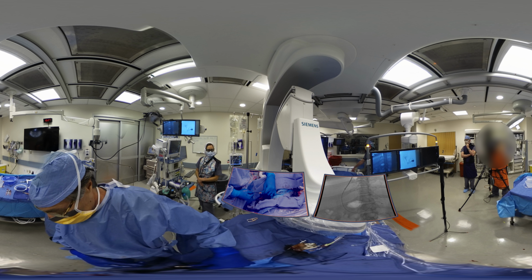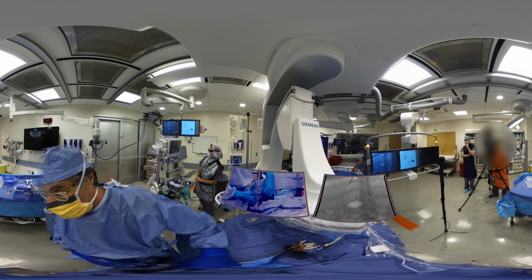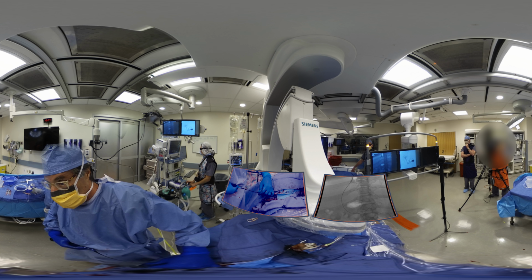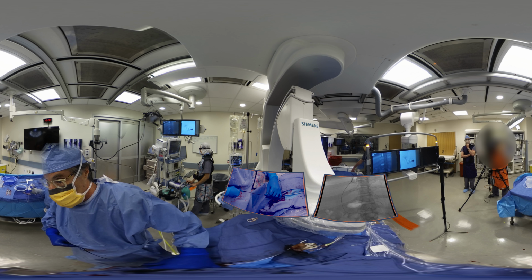The next thing I'm going to do is pin the balloon and bring the sheath all the way back to the top of the hepatic vein, because we're going to dilate all the way back. And why have to move it in steps? And now we're going to bring the balloon back into position for the first dilation.